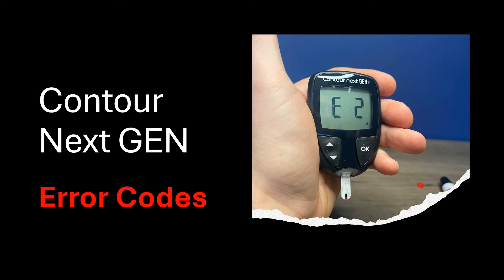Hi, this is Josh, pharmacist with Learn Blood Sugar Testing. I'm going to go over some potential error codes that can occur with a Contour Next-Gen blood glucose meter.